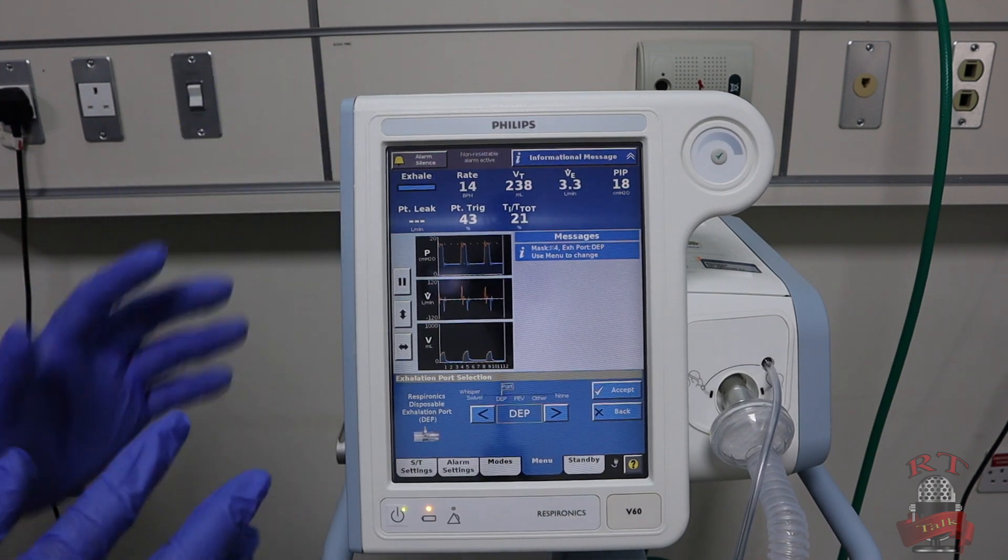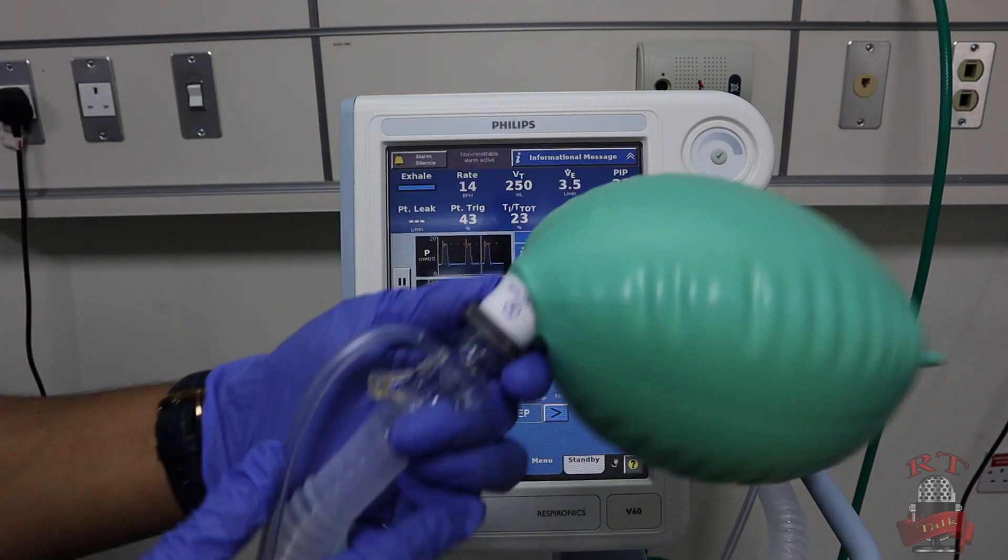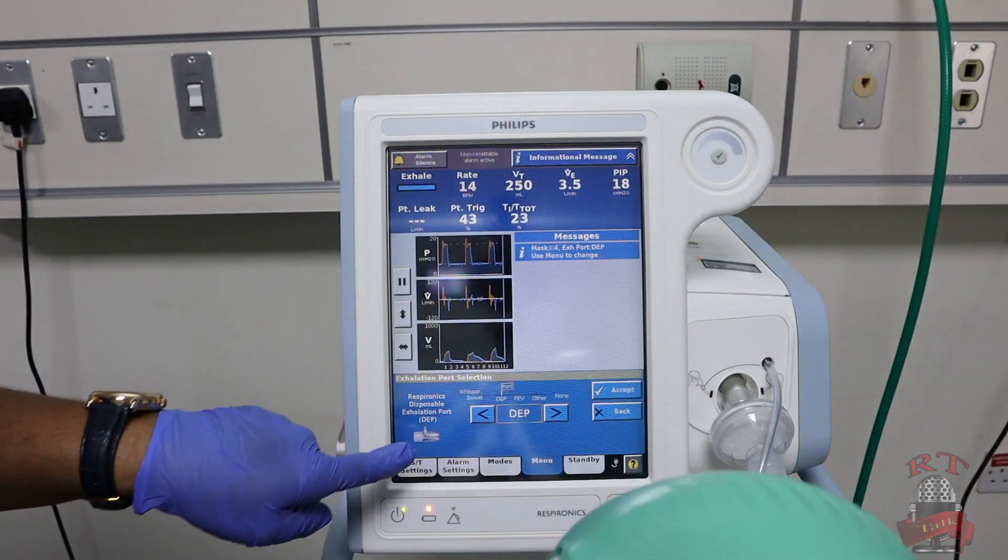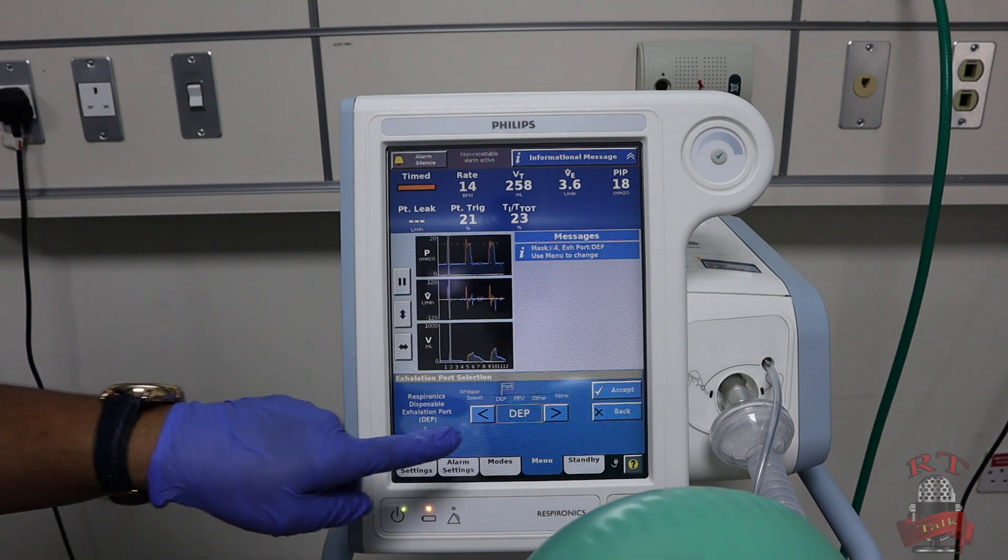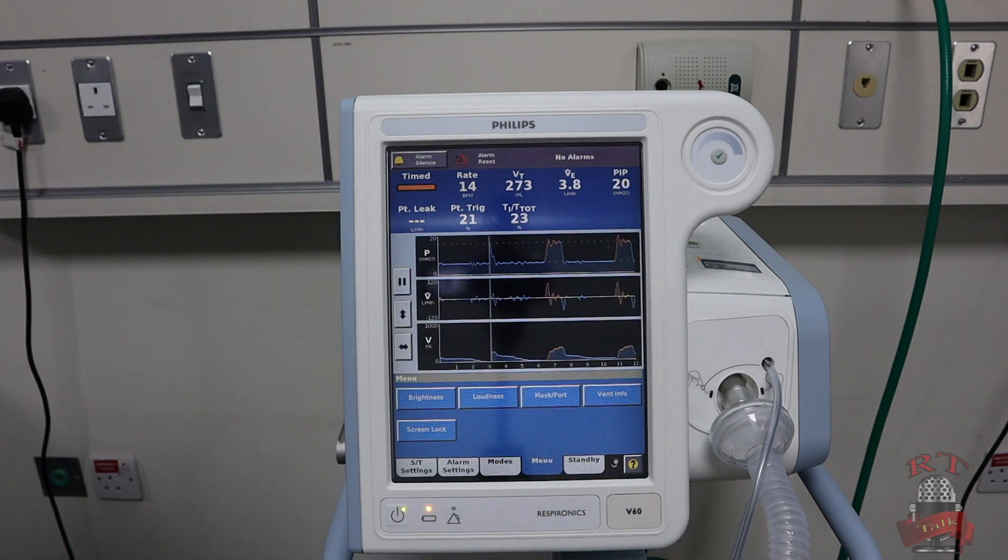Accept. Then you will select the type of exhalation you are using. The one we are using right now here is DEP, this one. It will be in the same picture also in the corner. So I will accept. Now I'm ready to set up my settings.